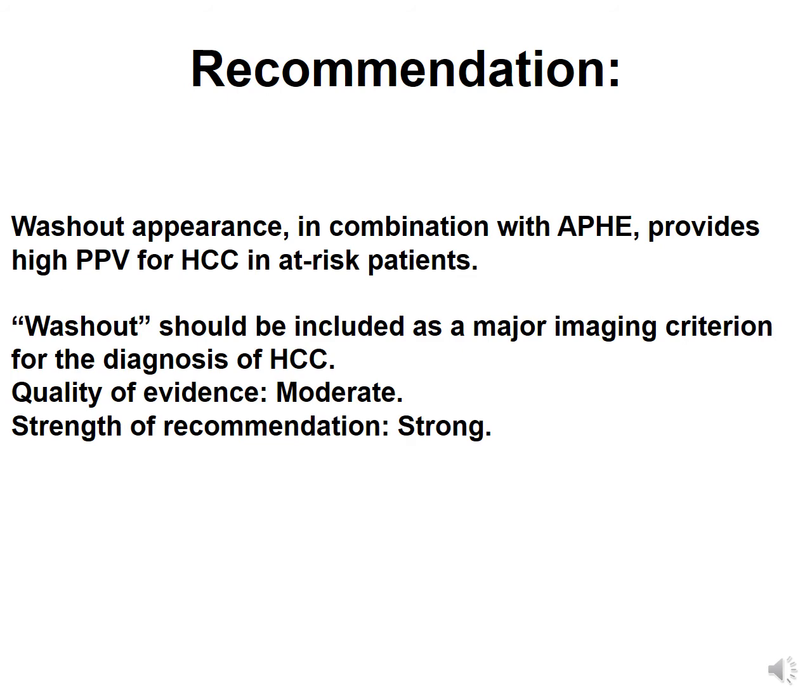So the recommendation is that washout appearance in combination with arterial phase hyperenhancement provides high positive predictive value for HCC in at-risk patients, and the washout should be included as a major imaging criterion for the diagnosis of HCC.